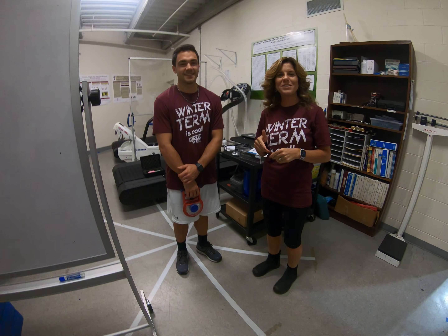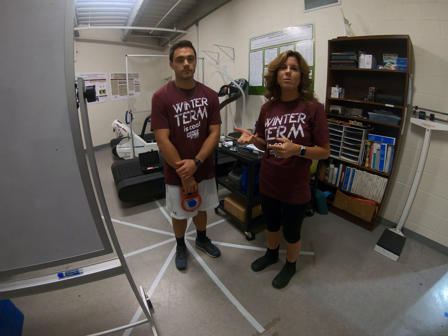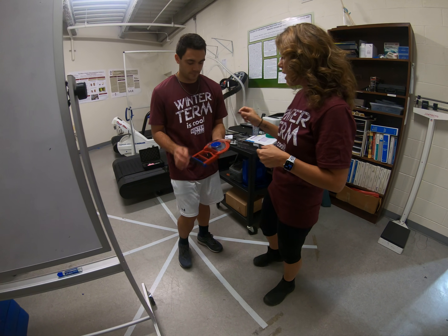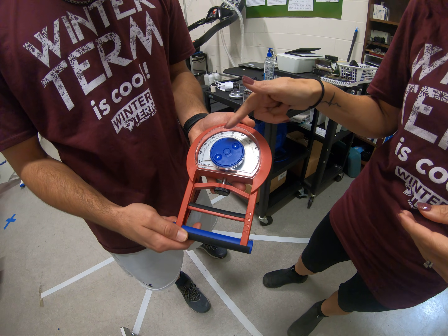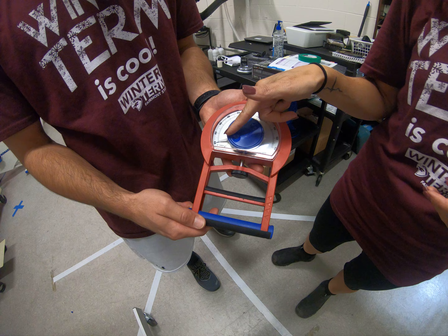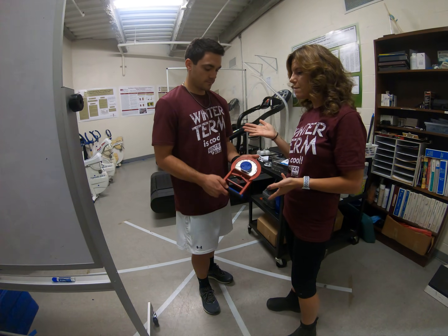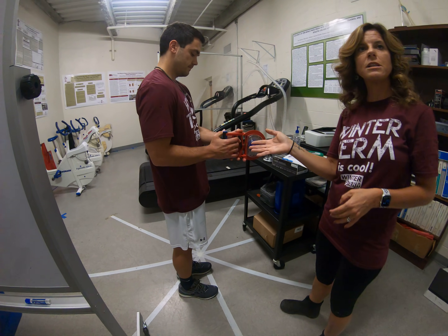Hi class, we are going to do the grip strength today to show you the upper body strength and an assessment for upper body strength. The dynamometer should be set at zero when you give it to your client. Make sure that they're standing up when you give them the dynamometer and have them hold it comfortably in between the hand.